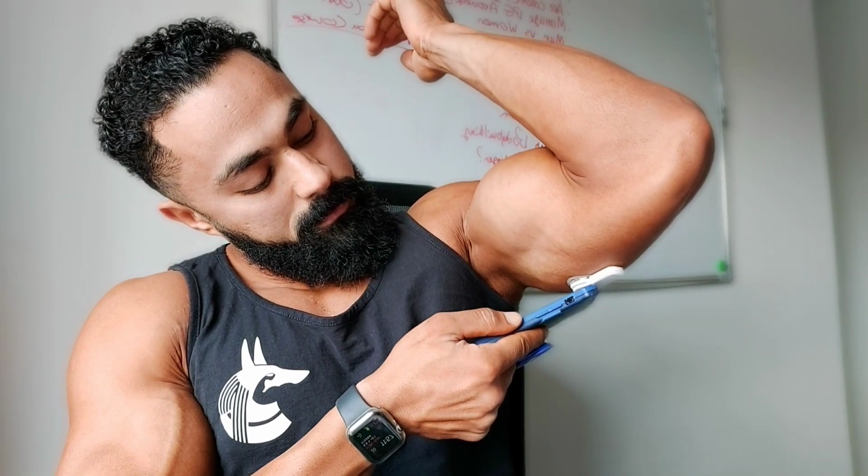So I'm gonna be measuring my blood sugar first with, as I said, the finger pricking device, and then I'm gonna measure it from the DEXCOM app for the DEXCOM values. So here, where it says 5.4, I have it also on my Apple Watch here, here you go. Can you see that? Nope, such a fail, but it says on my Apple Watch. This is the DEXCOM and the blood sugar, the finger pricking. Libre, I'm just gonna check glucose on the phone, just like that. Here we go, give a value, yeah.